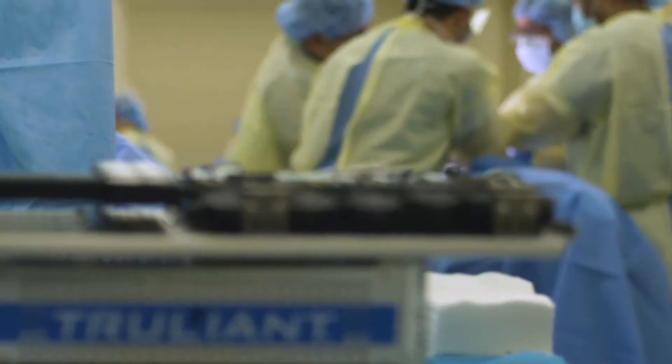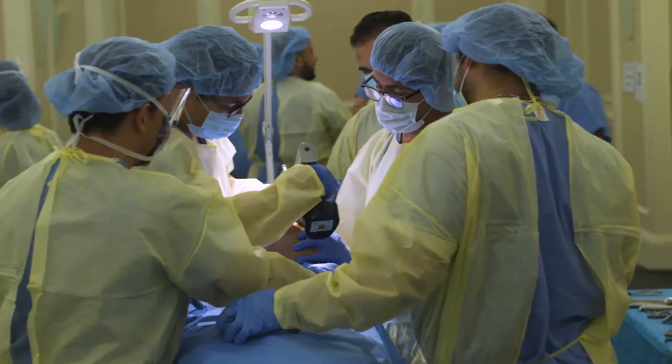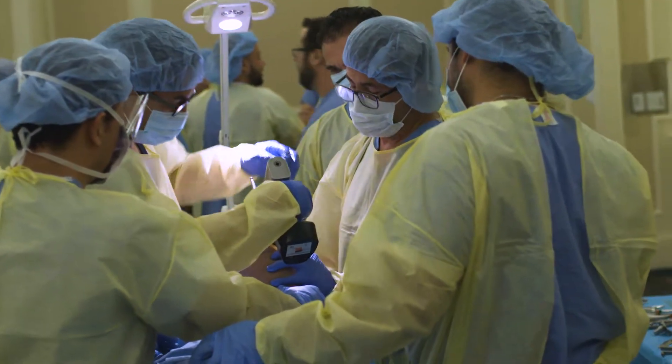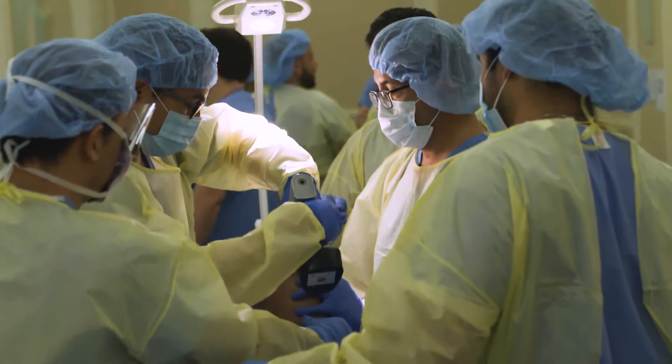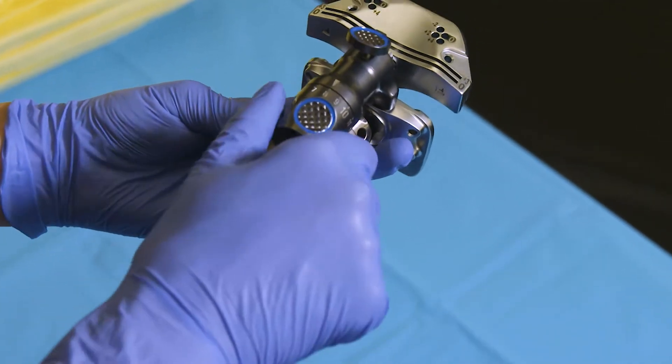The thing about Truliant is that it's workable across many surgeons' workflows. They shaved weight where they needed to, but left the tools robust where they needed to. I've been happy with it so far. The weight is good in your hand — it feels good in your hand.